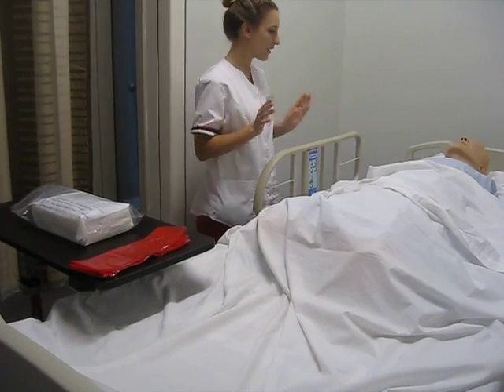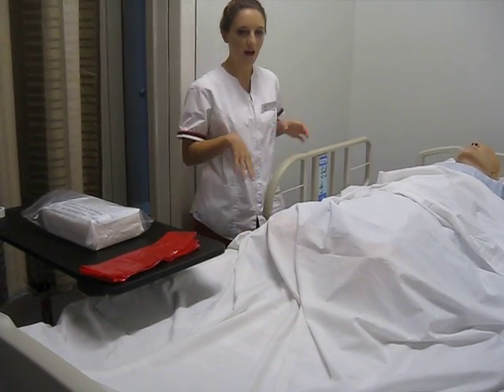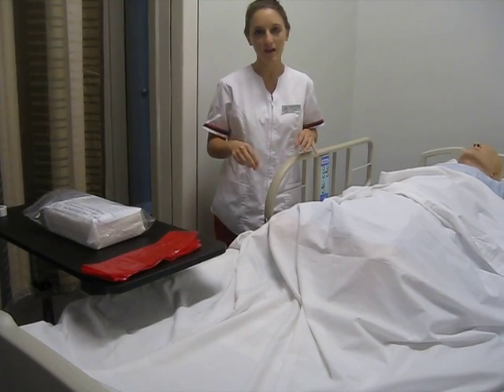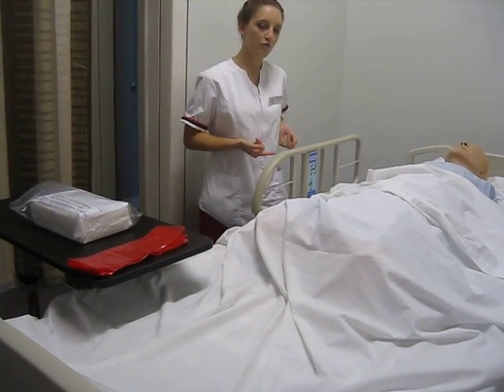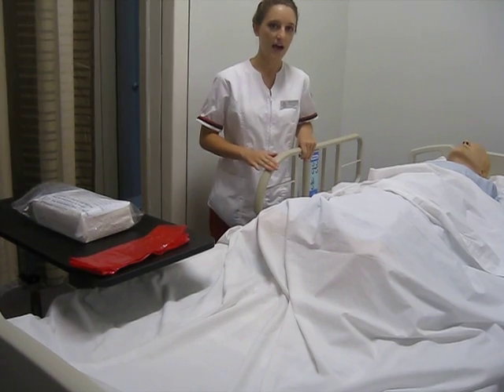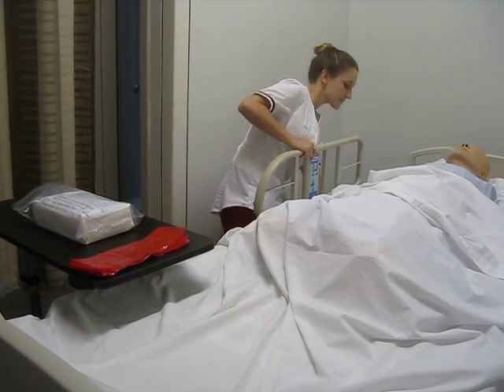I'm going to go ahead and wash my hands. This bed is broken, but normally at this point I would raise the bed to a nice working height, but it's already there. And lower the side rails.